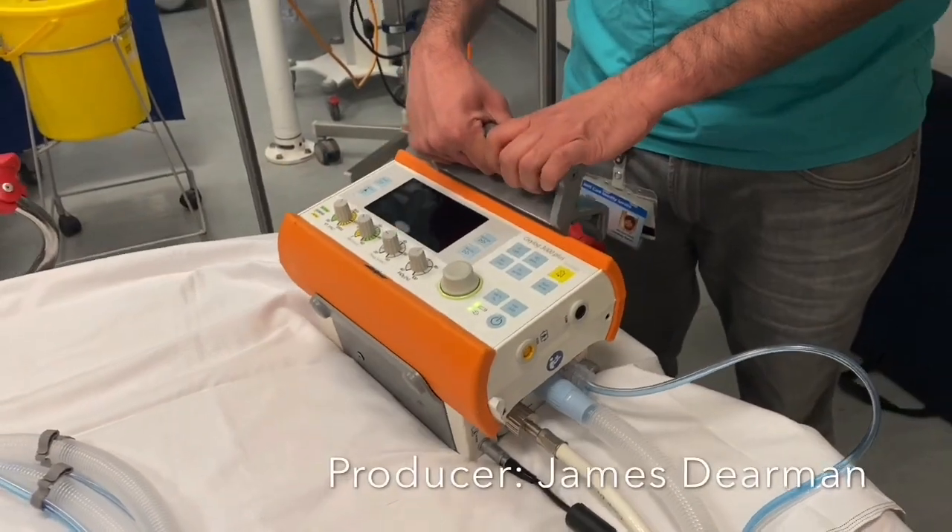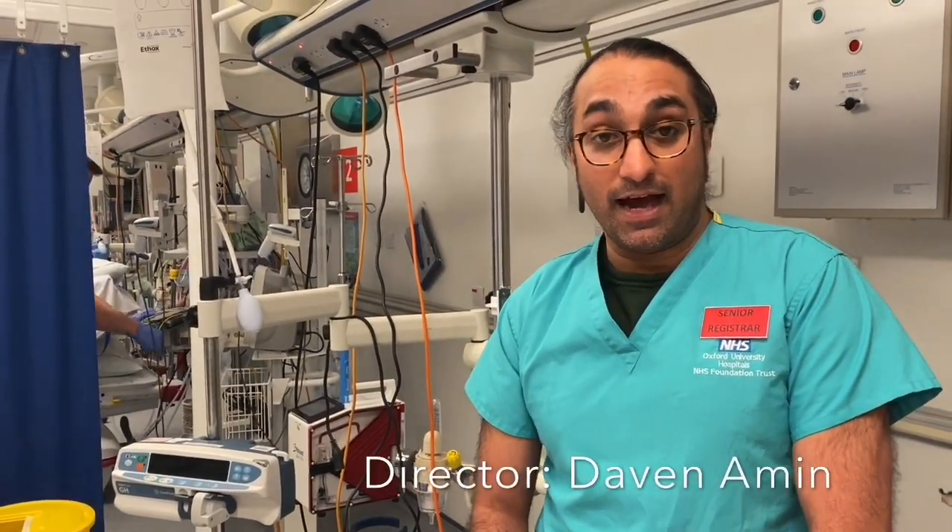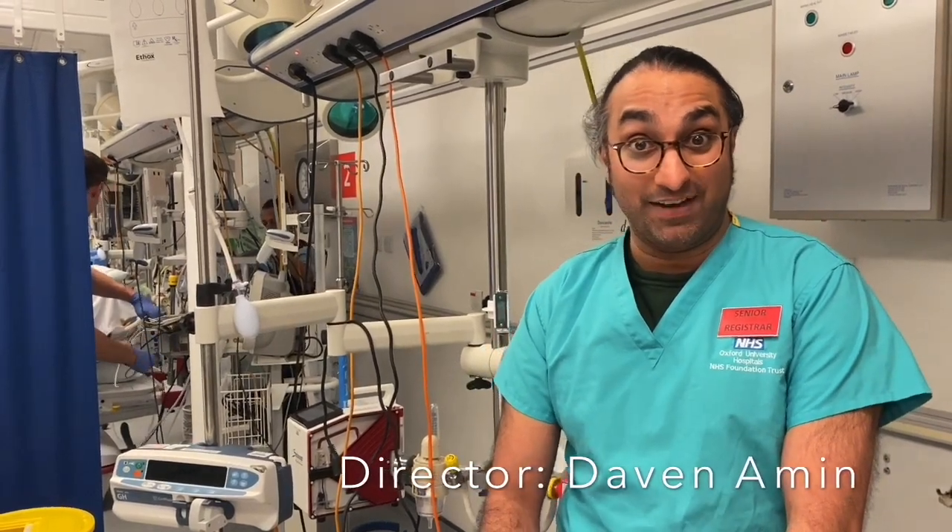So that's the basic setup for the Oxilog 3000 and we can now start thinking about ventilating the patient.